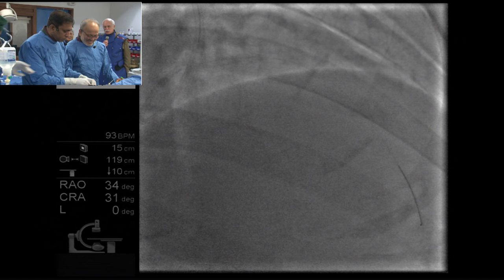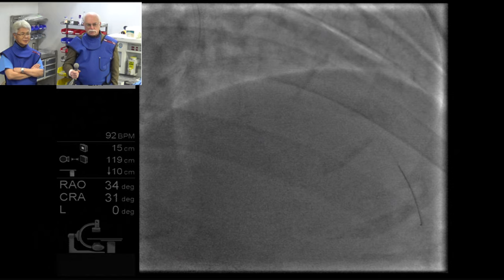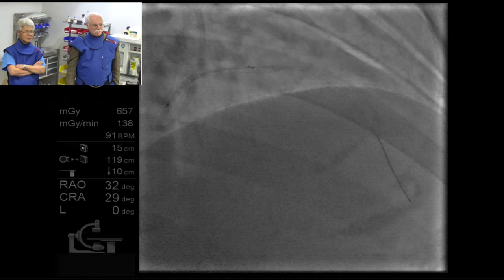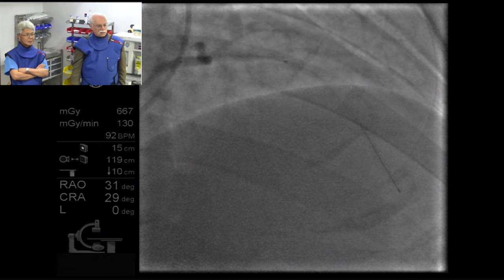We've used the peripheral drug-eluting balloons in the coronaries. The 4x40 is a small one. Two things are notable. One, they are impossible to get down. They're huge and really hard to deliver. Number two, all the patients have come back. They just haven't worked. So I'll ask my other colleagues here who have maybe more experience with DCBs.